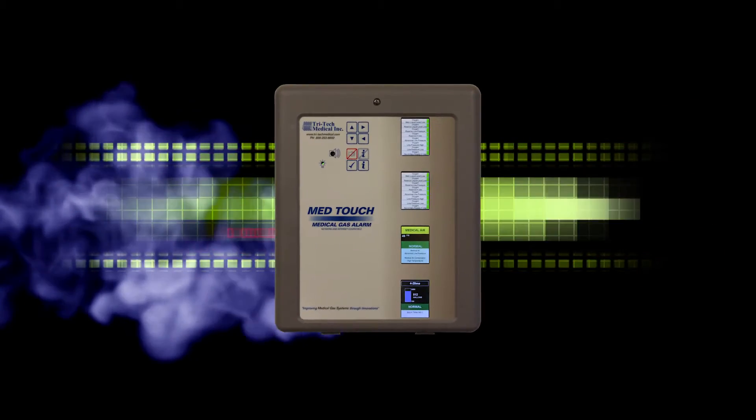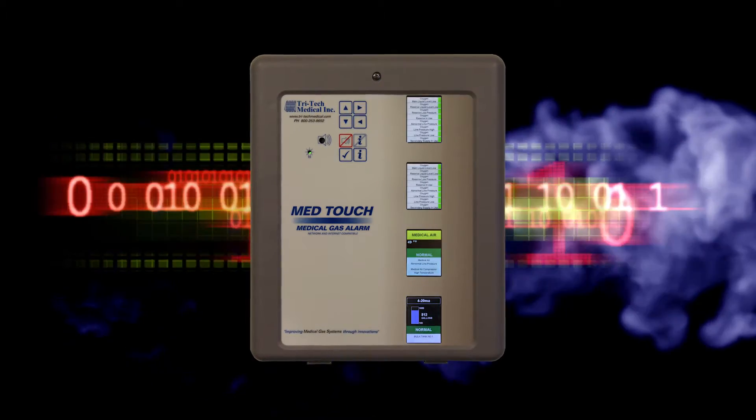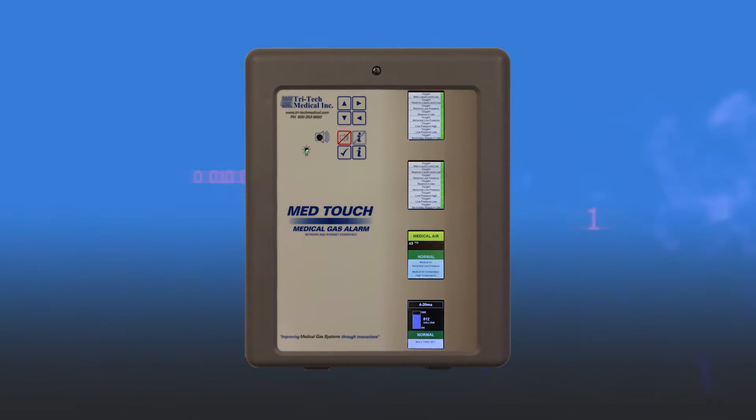Tritec Medical's MedTouch Master Alarm has been designed to provide exciting new technologies to meet the rapidly changing needs of the healthcare industry.